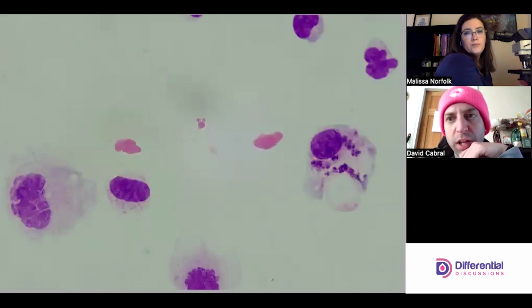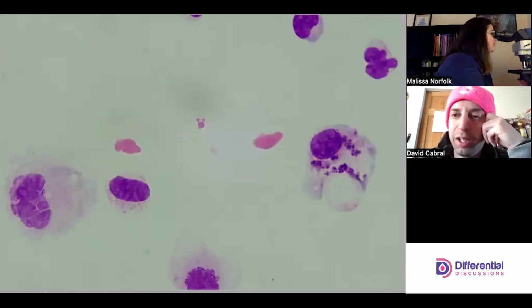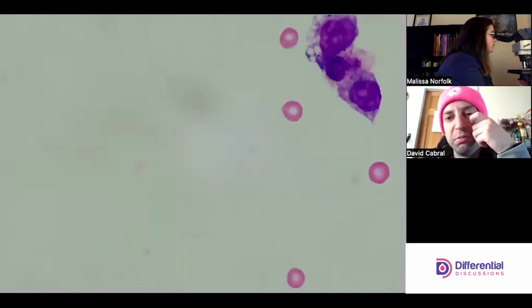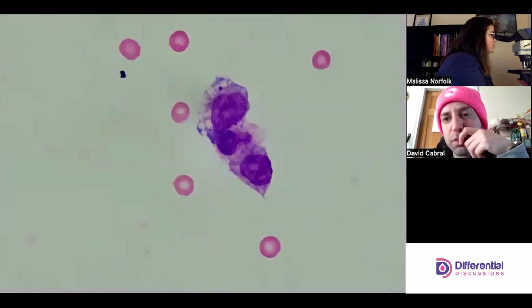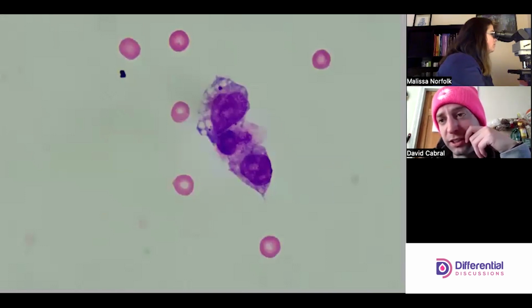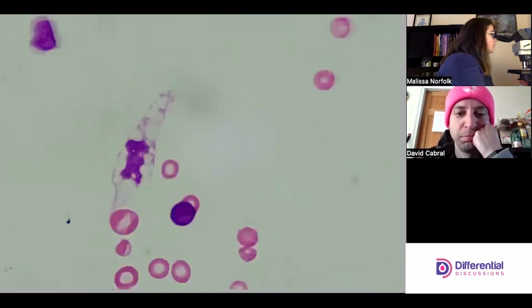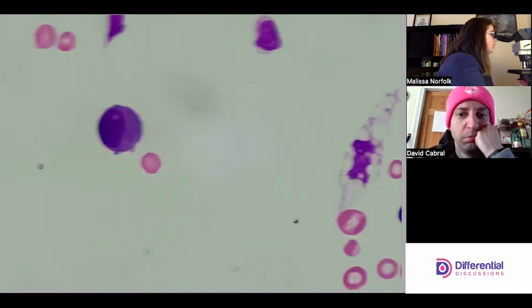Yeah, I agree. A lot of macrophages. Overall, a decent amount of macrophages, lymphs, a few basophils, a couple mesos. These look like kind of beat up macrophages. And that deeper, darker color is either suggestive of the things they're phagocytizing or that reactive sort of picture.